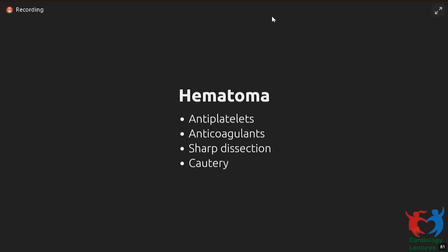In that case, at that point, a lead extraction from there might be difficult. You may decide in that case to keep it there, and in that case you need to use systemic anticoagulation. So the patient has to be on oral anticoagulation with therapeutic INRs. But if you put it into the coronary sinus, that is lying on the epicardial part of the LV, it is not lying inside the systemic circulation, inside the left ventricle. There you do not need to use anticoagulants. So that is just like a CS lead. So there you do not need to use anticoagulants.